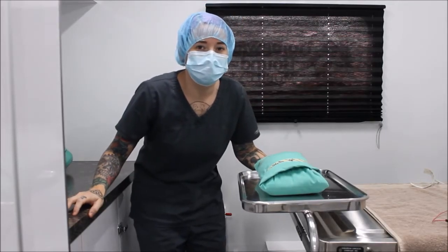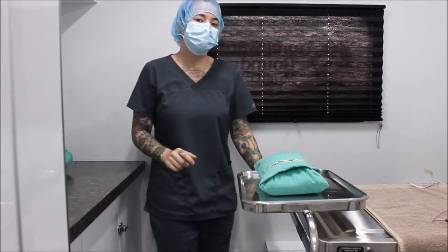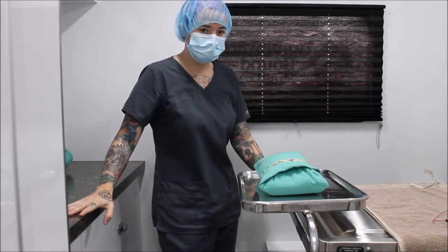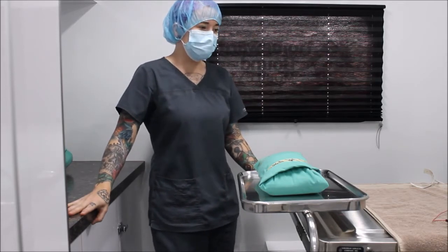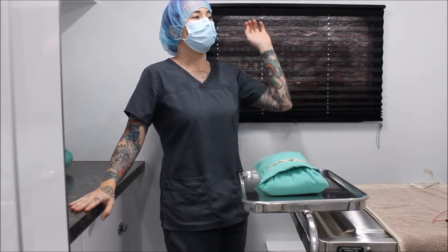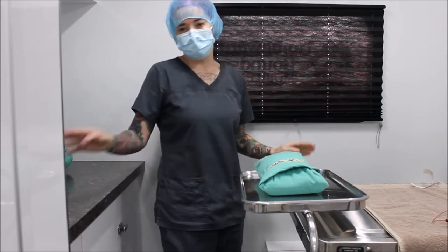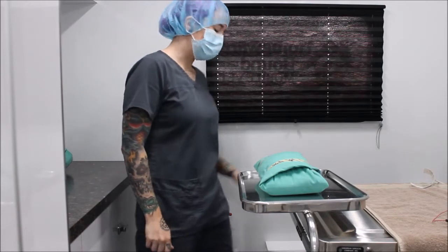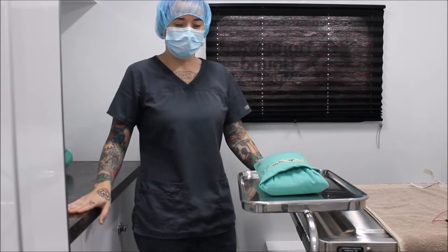In this video we're going to be setting up a sterile surgical pack for surgery. First, I've made sure that the operating room has been properly disinfected with a proper disinfectant per manufacturer's recommendations. We have cleaned all surfaces in the OR, the table, the surgery lights, the anesthetic machine, the Mayo table — everything has been properly disinfected, and the floor has also been mopped with the proper disinfectant.